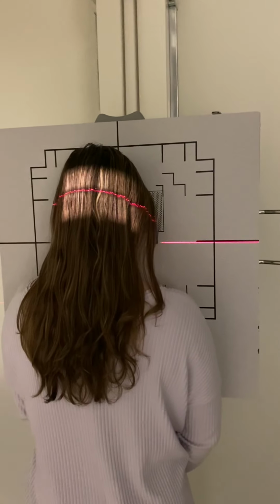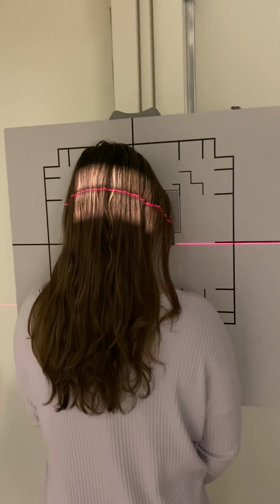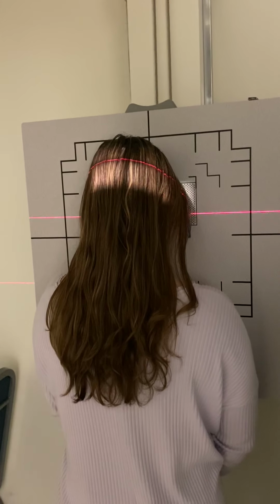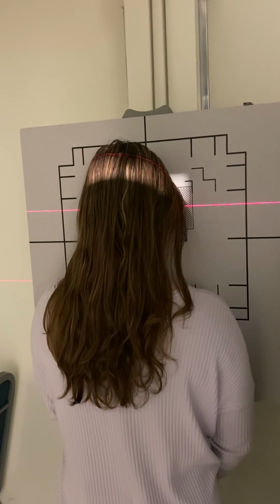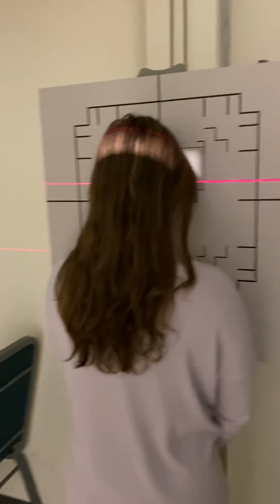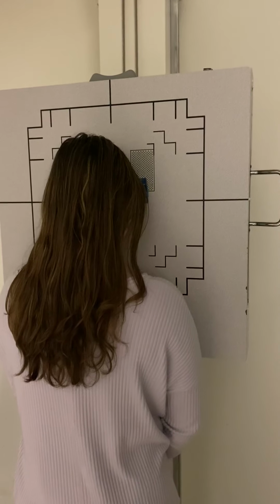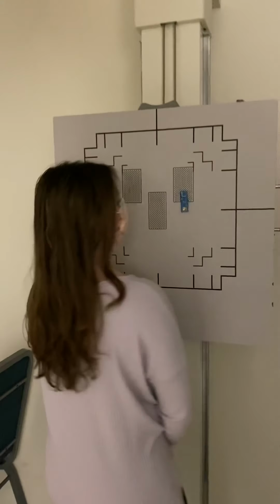The central ray should exit 3/4 of an inch distal to the nasion. I'm going to tell her to close her eyes and hold them as still as possible. And then I'm going to tell her to hold her breath. So hold your breath, close your eyes, keep them as still as possible, shoot, beep. All right, you can breathe and relax.